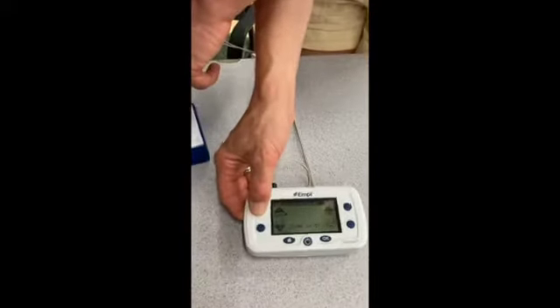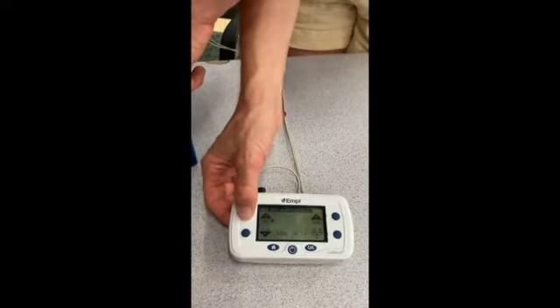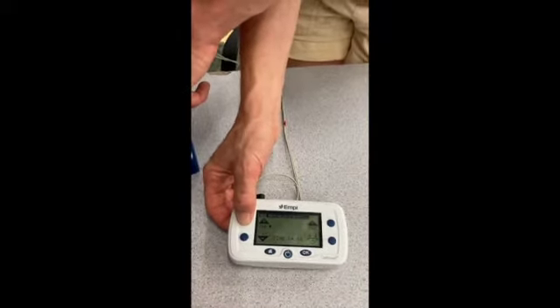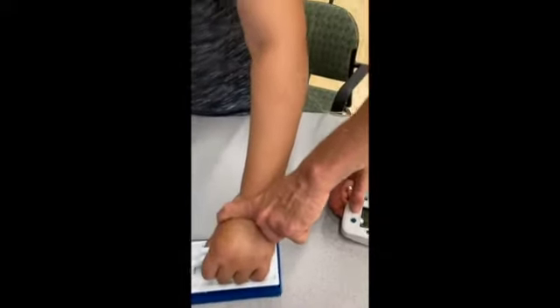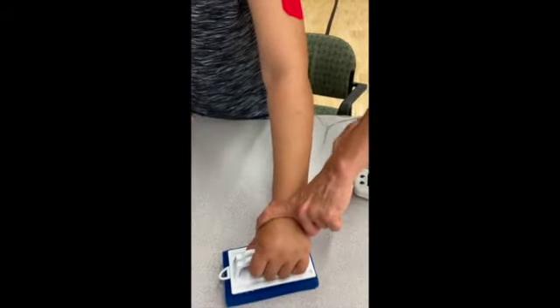Gradually increase the intensity by pressing the up arrow. You want this high enough so that the person feels a sensation and the muscle can produce a contraction. However, you don't want it too high where it is painful or intolerable for the person. This will be different for everyone.